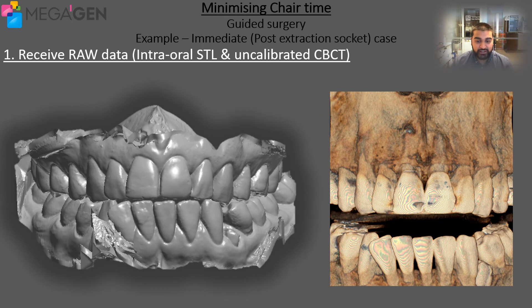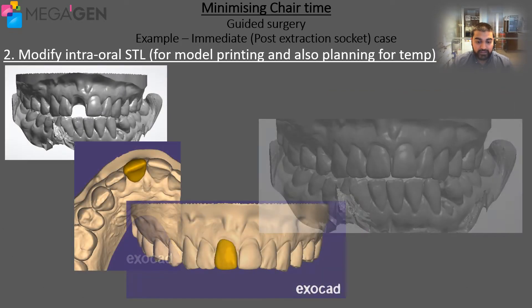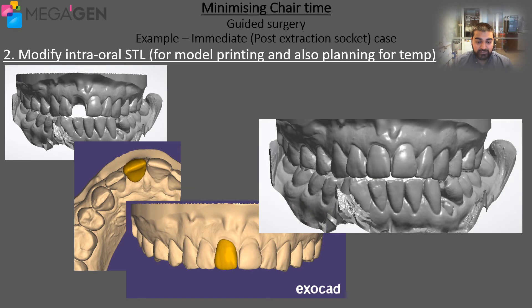The first stage of any guided surgery case is to acquire the digital information needed to proceed. The two pieces of information we need to acquire are the intraoral scan — or an impression which will then be cast into a stone model — and the CBCT information. Once we have the intraoral scan or the stone model, we can begin to process this information so that we can extract teeth if needed and modify the STL to suit our needs.